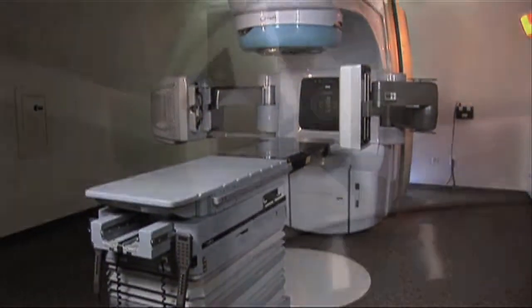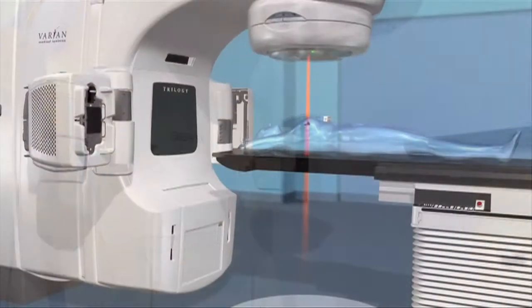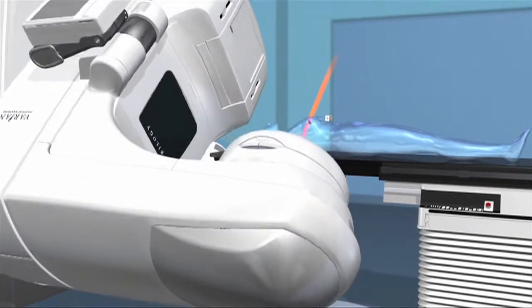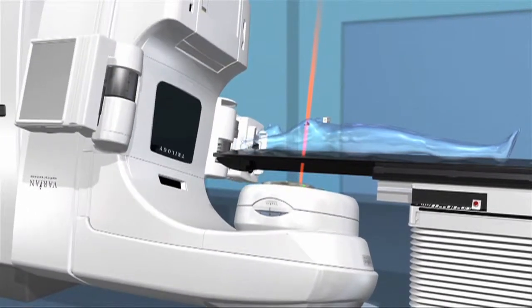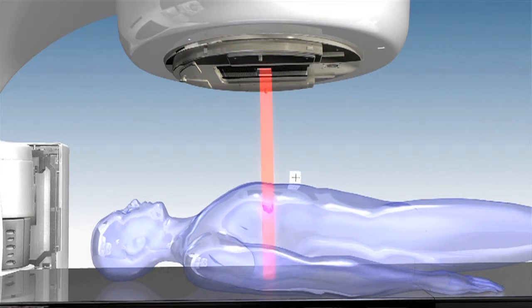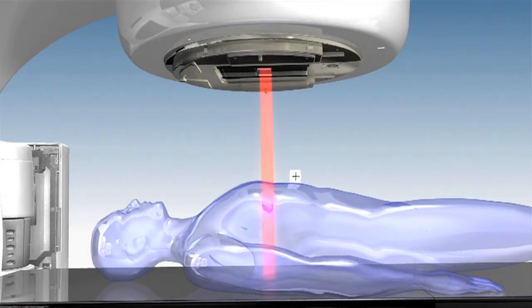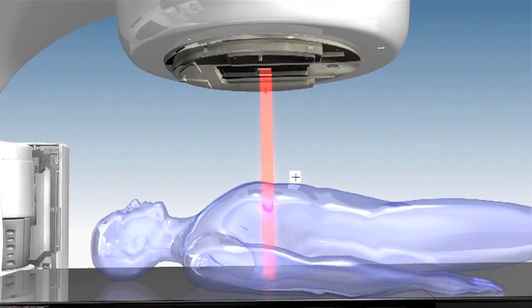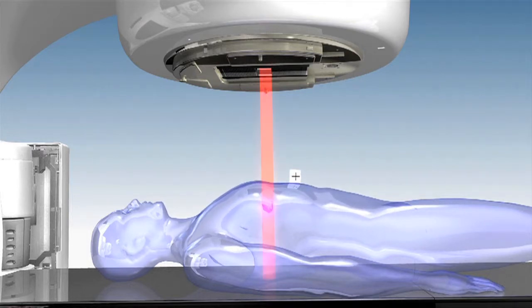There are several state-of-the-art systems used for EBRT. These systems integrate IGRT with 3D conformal or IMRT radiation therapy in one machine to deliver a very precise treatment. We also offer what's called respiratory gating, because when you breathe, structures in your chest can move, and if they move too much, we have ways to turn the machine on and off as we're giving the treatments so that we're only hitting the target when it's in the right position.